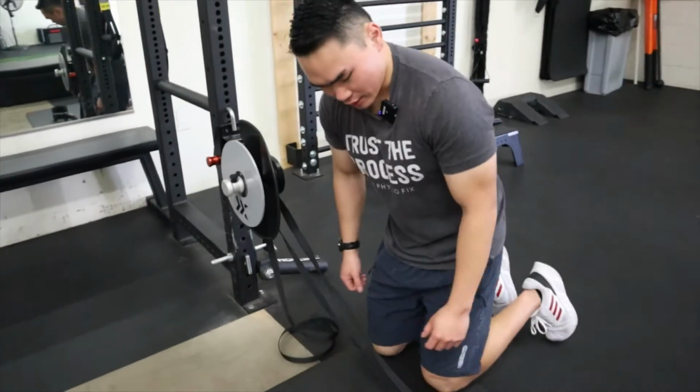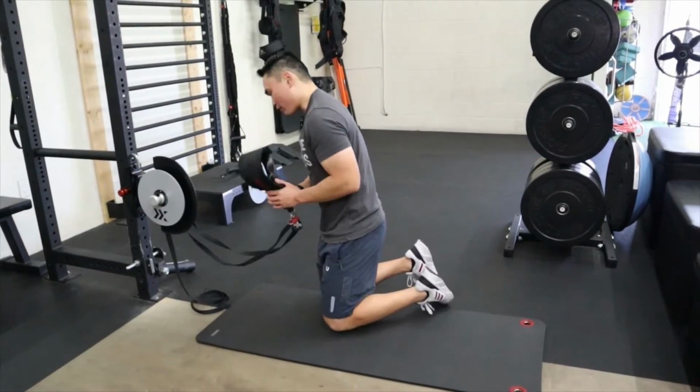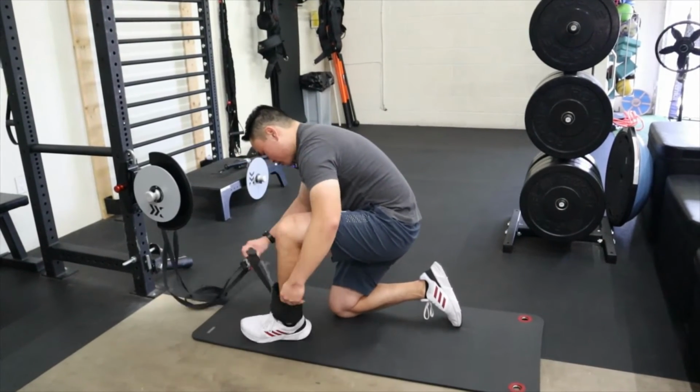So anyways, one of my favorite exercises to do on this with a lot of my ACL patients is to just have them lay prone and then put the cuff around their ankle, and I'll just do it now.